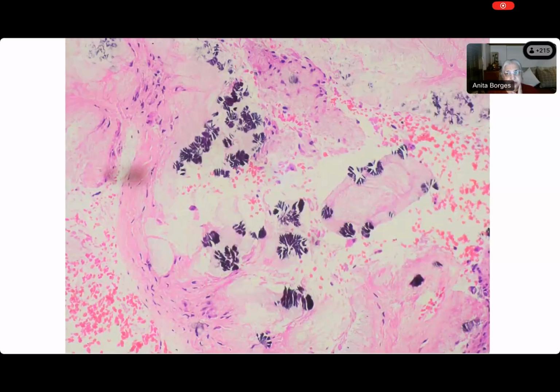All right. What do you want to say about the calcification over here? Are you going to say that this is only coarse kind of calcification? It has got a peculiar structure. Okay. What is the structure, Mansi? Ma'am, it is like a star-shaped calcification. Yes, Prayas, what is it that you wanted to ask? Ma'am, there are some crystals looking like needles.